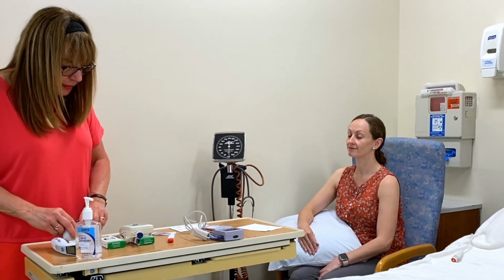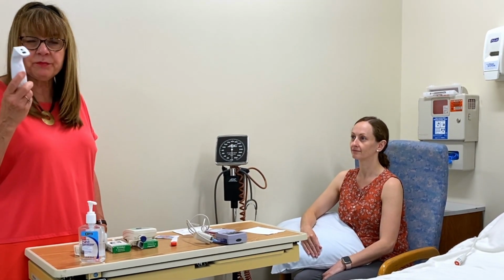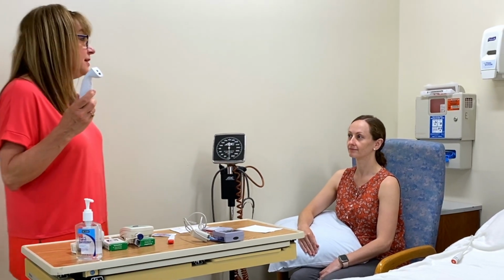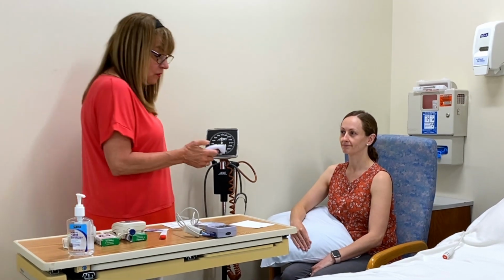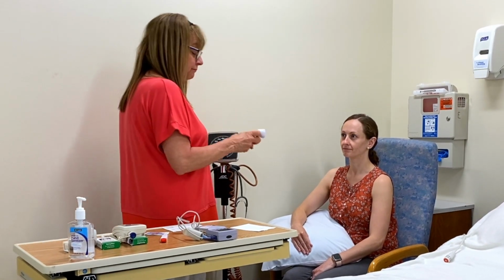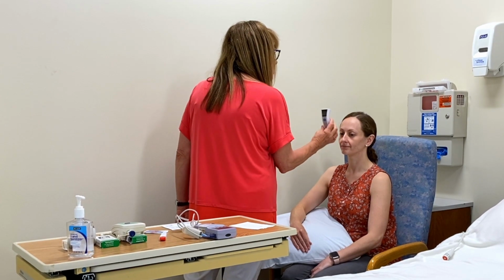Now the last mechanism that I'm going to use on Monique is our temporal. And you can see now with the pandemic going on that they're using a lot of temporal thermometers, which is the best way because you don't really have to touch a patient. So with this one, you just place it this way.